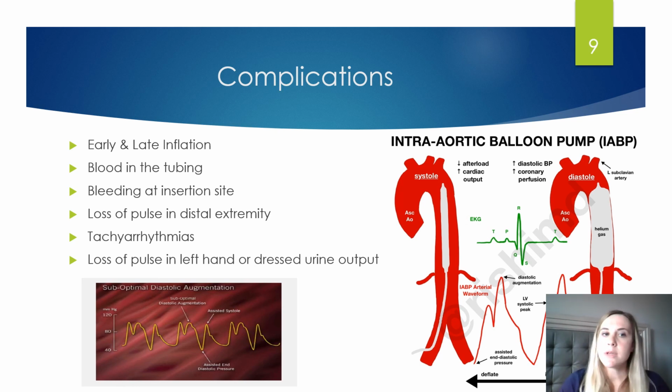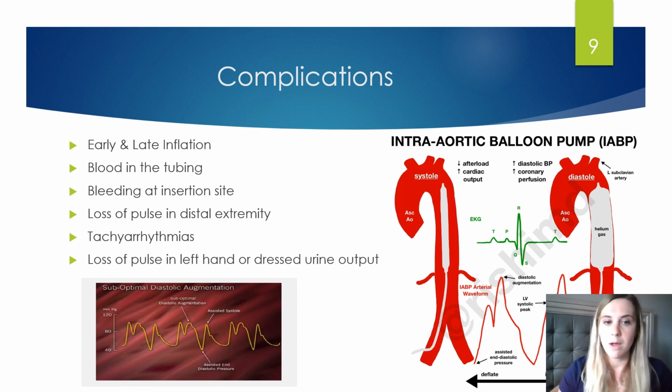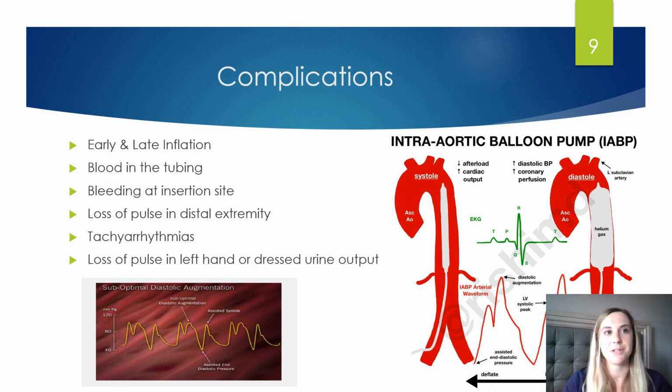So all these are some of the main complications that you'll notice with an intra-aortic balloon pump. Thankfully, Alice didn't have to have any of these complications. She was able to successfully bridge to a bypass surgery and is doing well. So thank you so much.